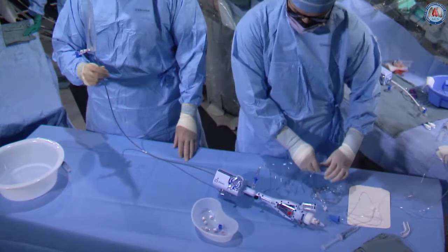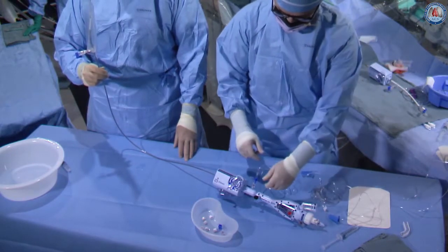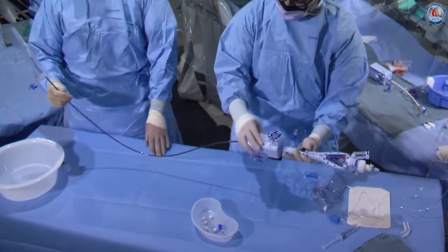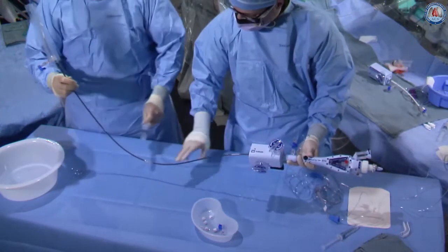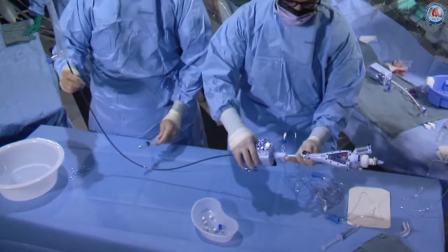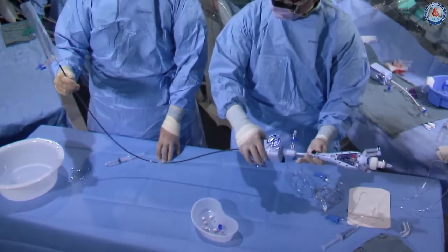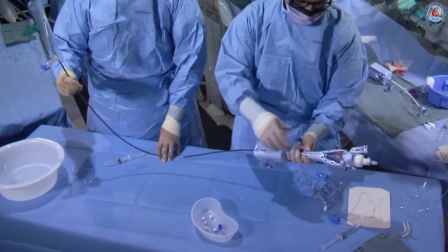We start our flow of heparinized saline through our pressurized bags, de-air the stopcock, and turn on the device. Throughout the length of the catheter you can see that the air bubbles slowly come out. During that time you want to slowly go back and forth with the CDS handle in order to move any bubbles out of the shaft itself — about 10 times with that.